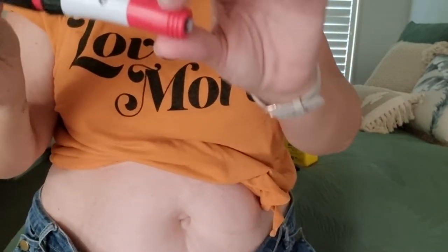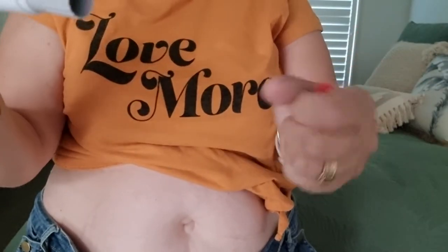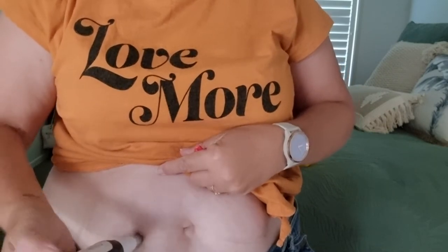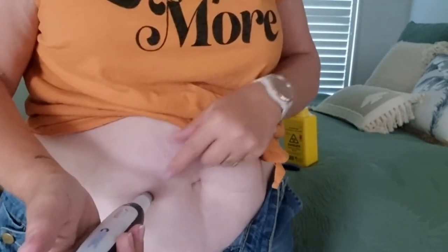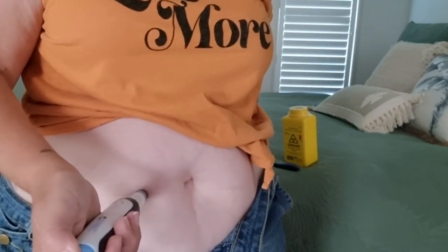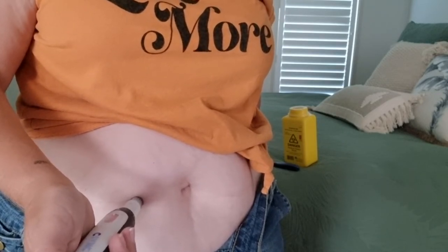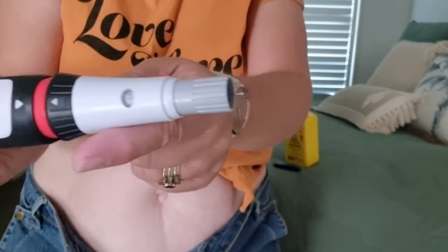I'm going to do my belly with this one — excuse the fatness. Pull the cap off, so the cap is off and ready. Put it on my belly, push it in — hopefully you can see that — and it's white.